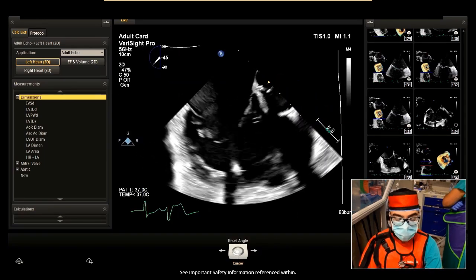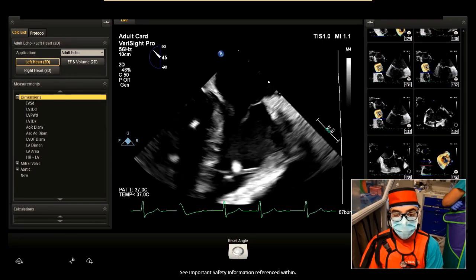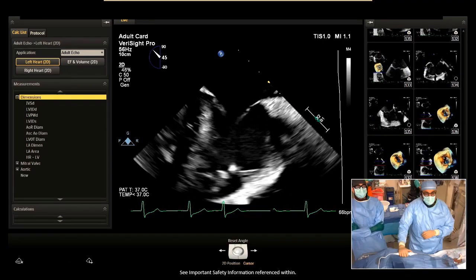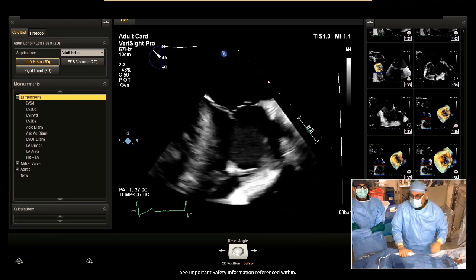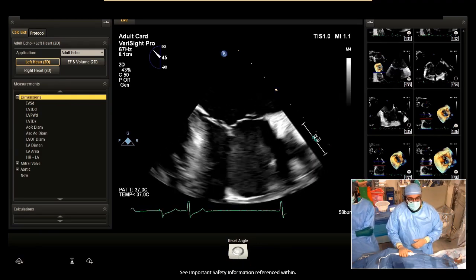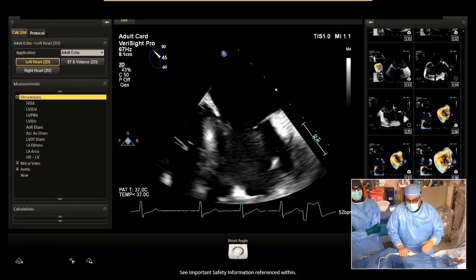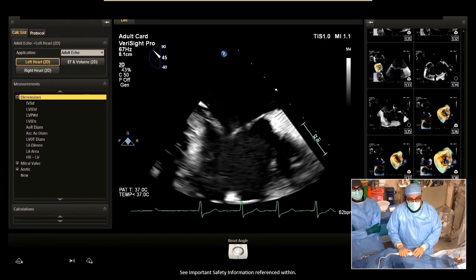Going straight to 45 degrees. So that's your grasp view. And that's your grasp right there. And so look how beautifully you can see the septal leaflet and the anterior leaflet there. And so this tells us, again, with this little pre-procedure case planning that we don't always do, but at least here for the purposes of illustration and education, that this allows you to very quickly see the septal and anterior leaflet, and we know this is what we're going after.